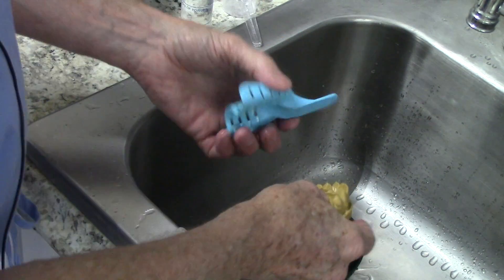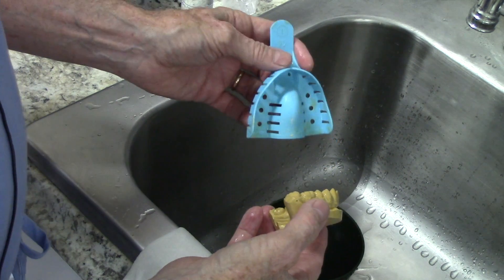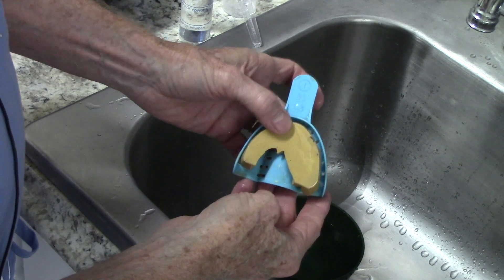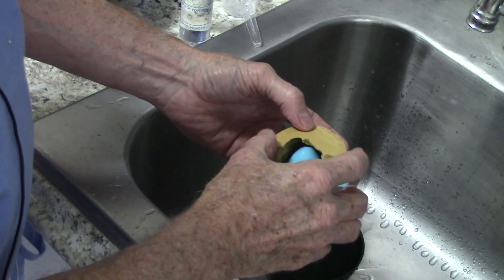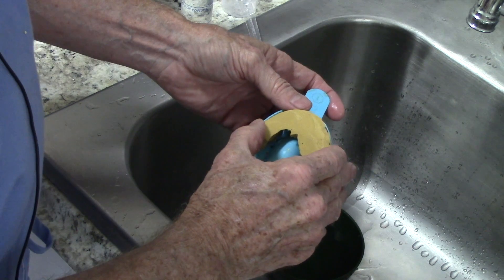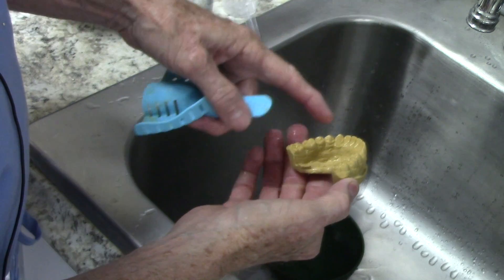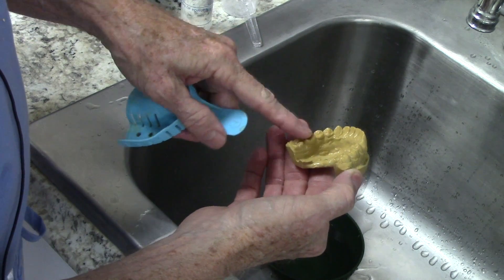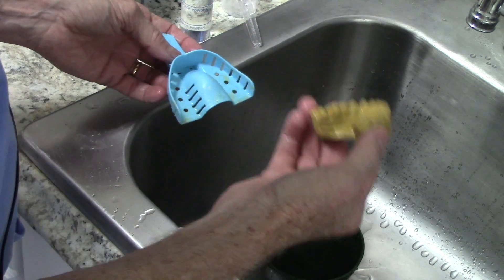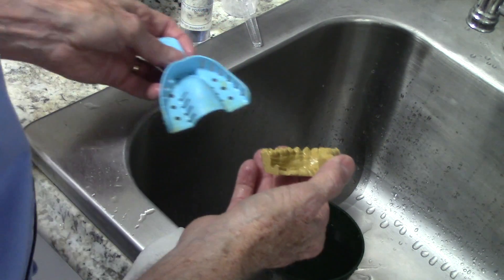Now I use this impression tray. It's a disposable tray but I use it over and over. I like to get a tray that gives me plenty of room. I want to make sure I go down into the impression material but I don't want to go all the way down and touch the tray. If I do, it's going to leave a cusp tip touching the tray, which could lead to a misrepresentation of the anatomy or cause bubbles. So I just want it to be in the impression material but not all the way through.